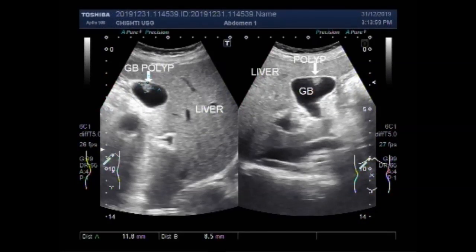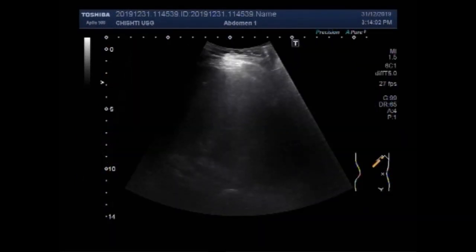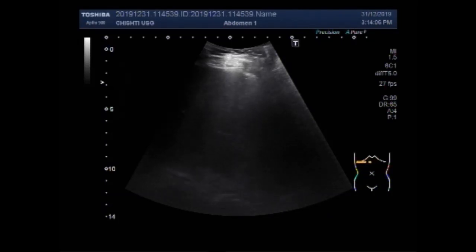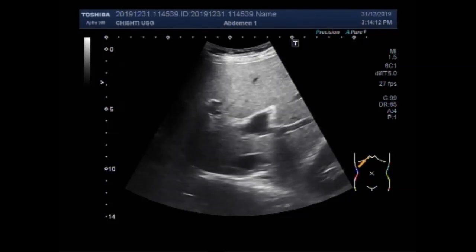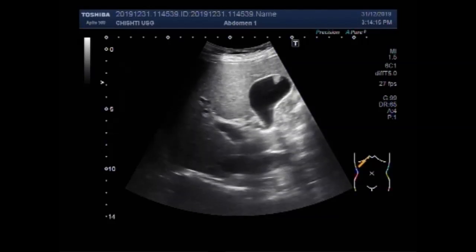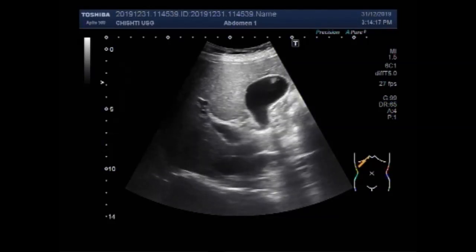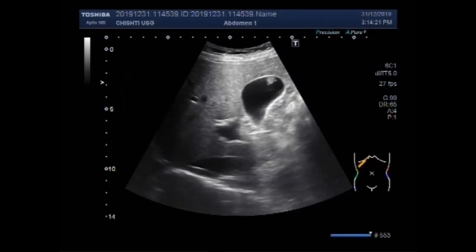Dear viewers, I hope you are all fine. This ultrasound video shows a large gall bladder polyp. You can see the gall bladder and a polyp is seen there at the fundus of the gall bladder. This one is the gall bladder polyp.